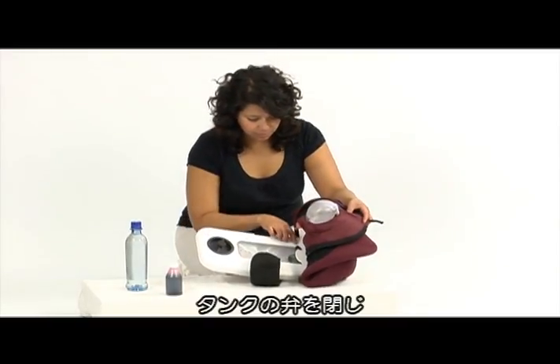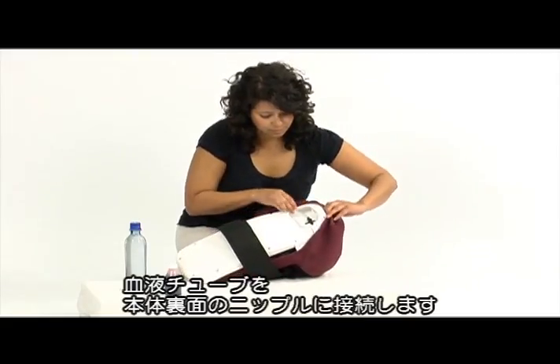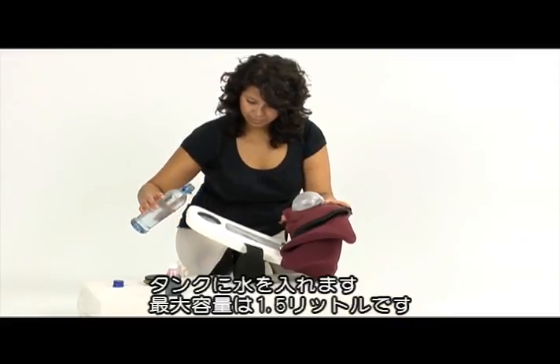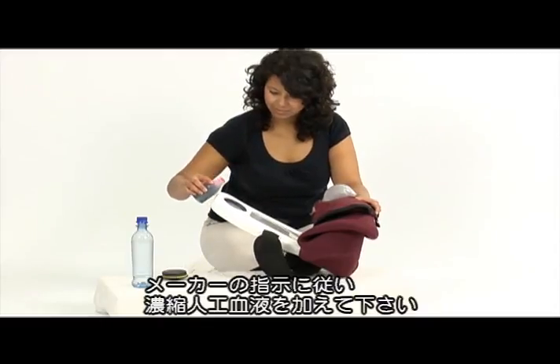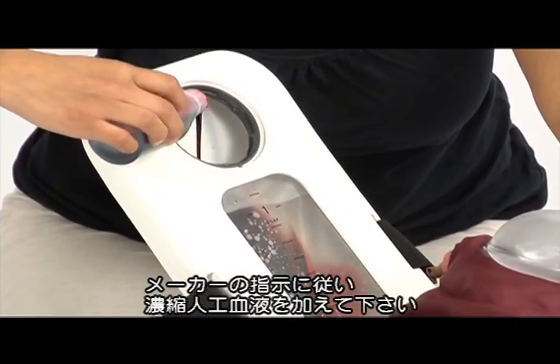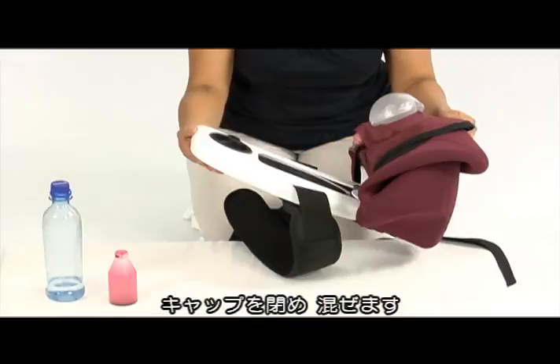Check that the valve of the blood tank is closed. Ensure that the blood tube is connected to the blood nipple on the back side of the skeleton. Fill the blood tank with the desired amount of water, up to 1.5 liters, and add concentrated artificial blood according to the manufacturer's instructions. Return the blood tank cap and mix well.